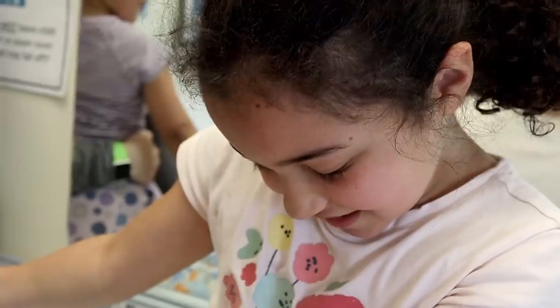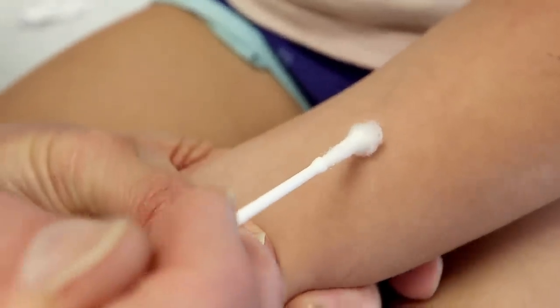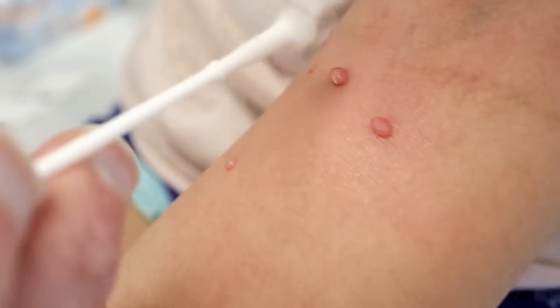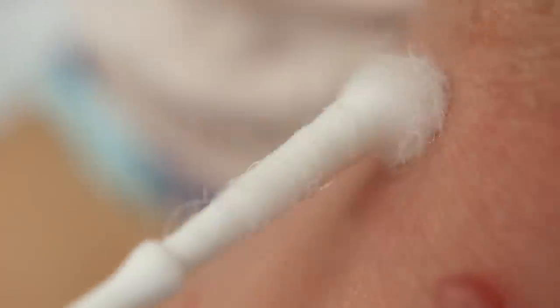You're being very brave. You are doing amazing. Not even sure we numbed that one. Can you tell the difference when we don't numb it? Not really. I didn't think so. So we're gonna give these two big ones an extra bonus freeze. Still smiling — I think your sister's helping a lot.